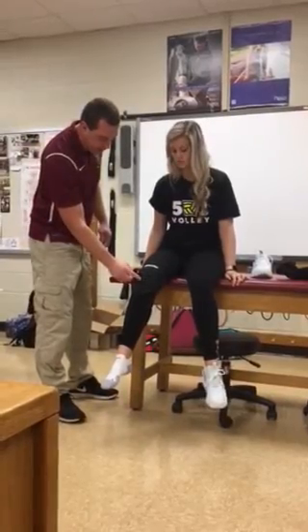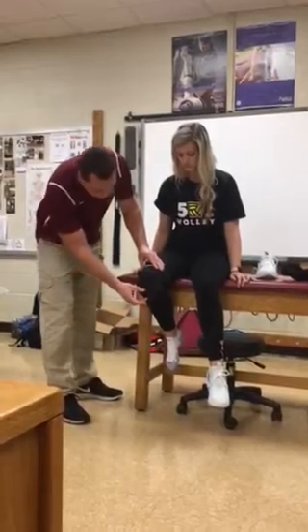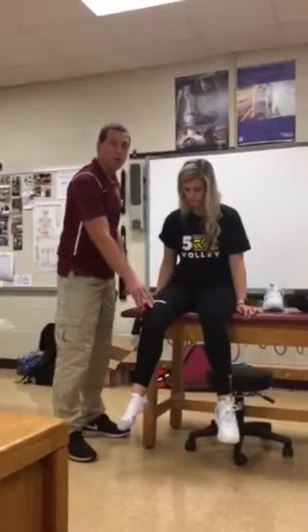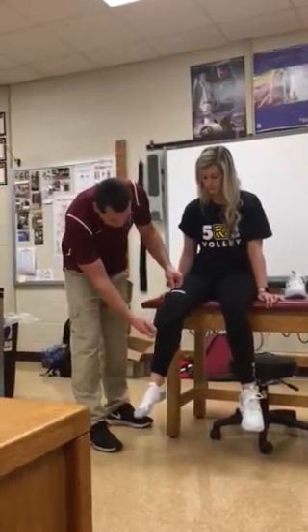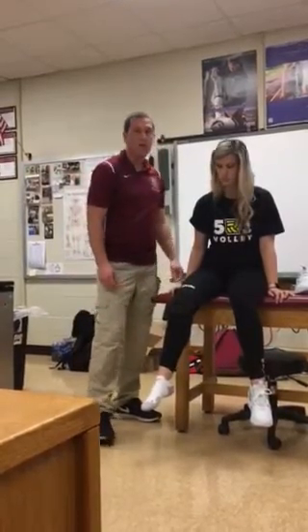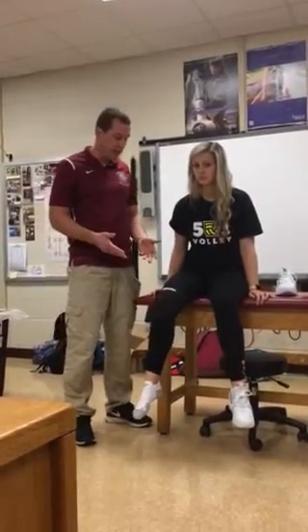We want the knee to hinge right in the center of this pad. We've got a little bit of padding below over the patella tendon and the tibial tuberosity, and we've got some padding above on the quadricep tendon. You don't want a lot of space in here. This one actually fits her pretty good; I don't think this is going to slide down too bad. We could look at using a medium, but if it's too tight then they can't move the joint, and that becomes a problem with them doing their sport because you can play with this on. This is the reason why we put it on so they can continue to play even though there's still an injury.